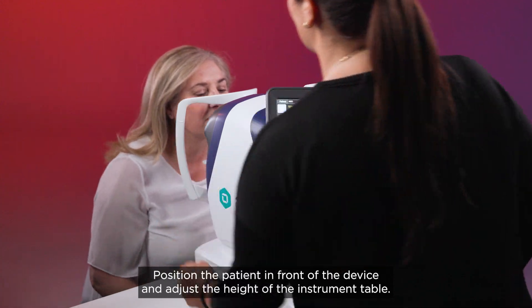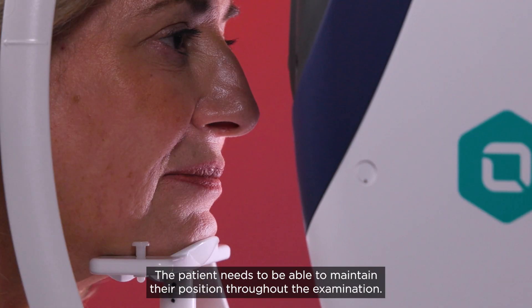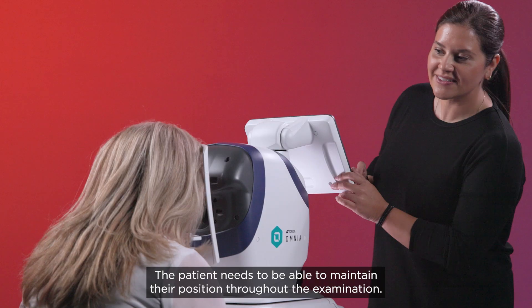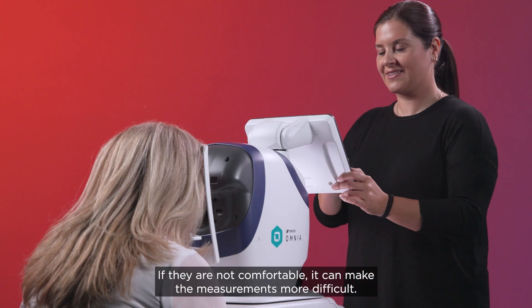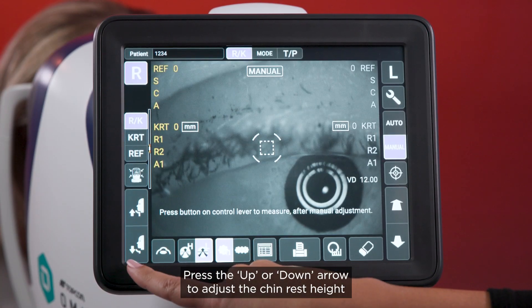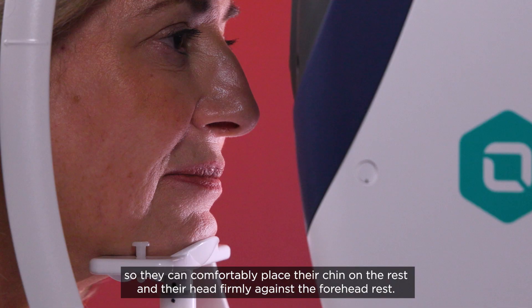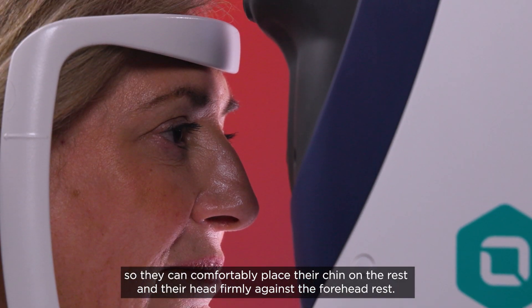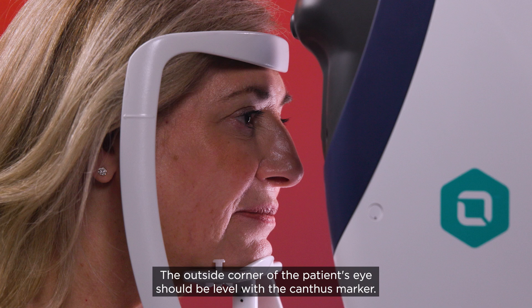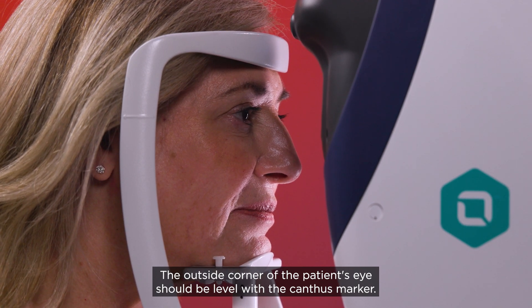Position the patient in front of the device and adjust the height of the instrument table. The patient needs to be able to maintain their position throughout the examination. If they are not comfortable, it can make the measurements more difficult. Press the up or down arrow to adjust the chin rest height so they can comfortably place their chin on the rest and their head firmly against the forehead rest. The outside corner of the patient's eye should be level with the canthus marker.